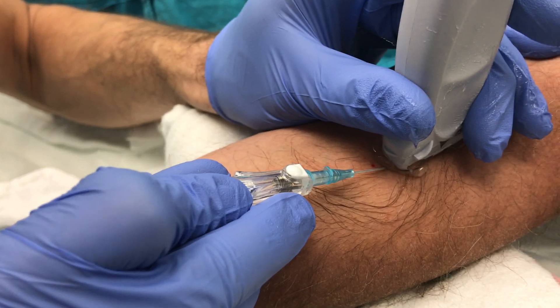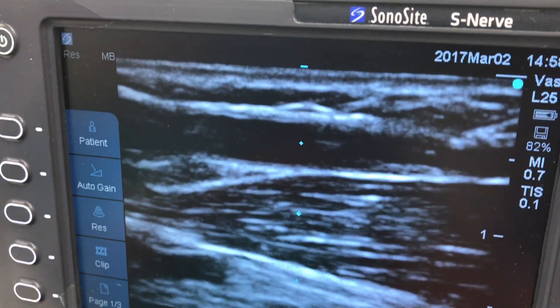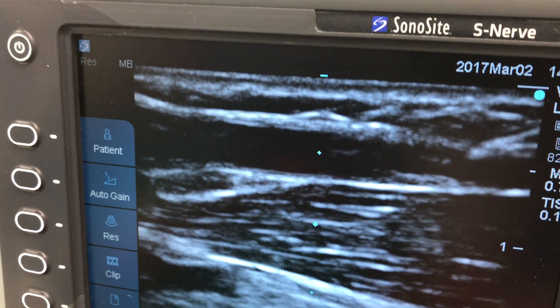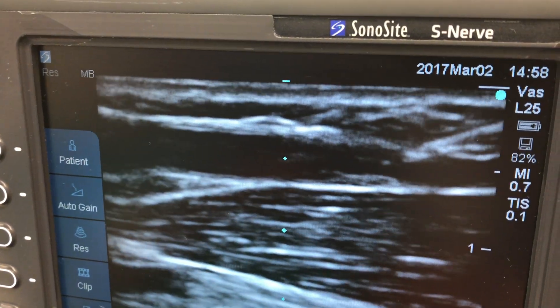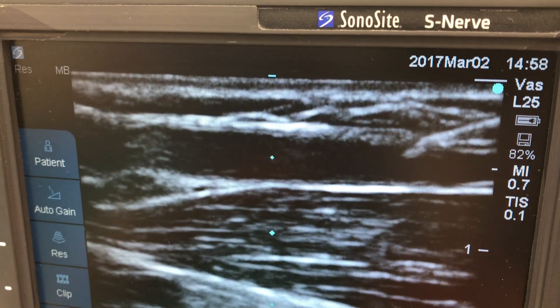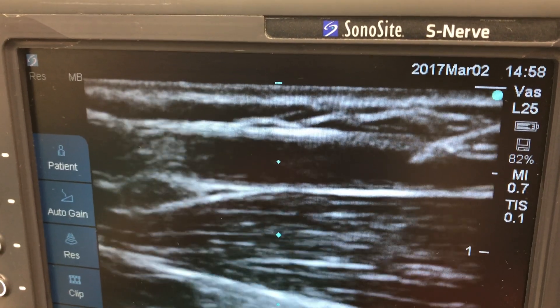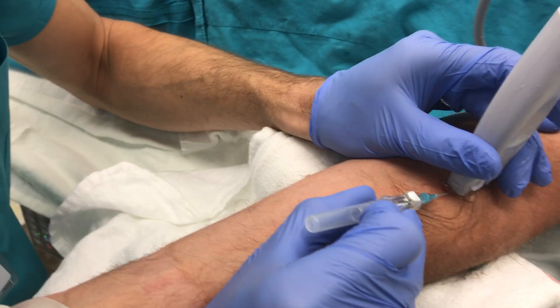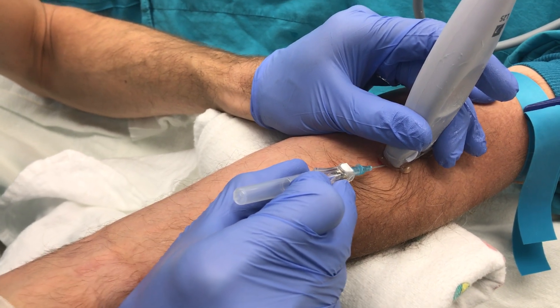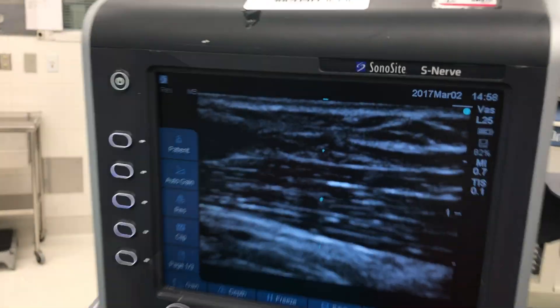When I feel like I've got it under the probe, I look up at the screen and I should be able to see my needle already — and you can see it coming in from the right side of the screen. The key here is you need to have a really sharp image of the needle and a really sharp image of the vessel in the same frame. On the screen you can see the needle is there.